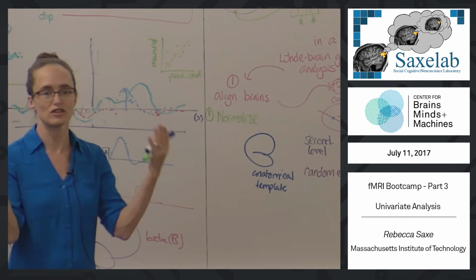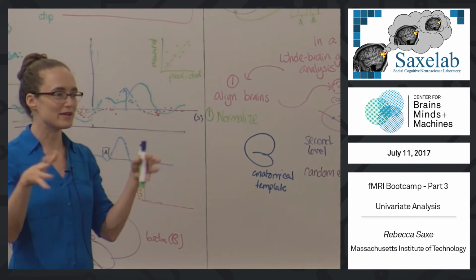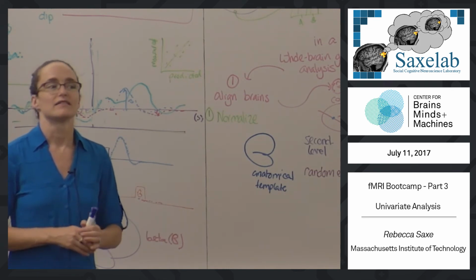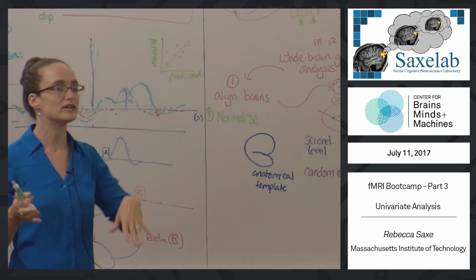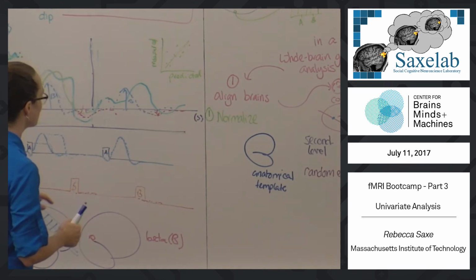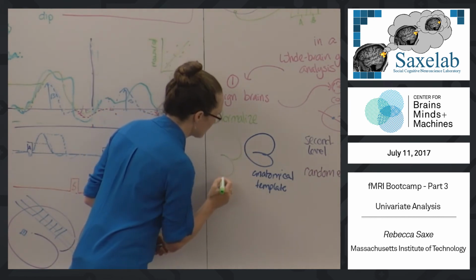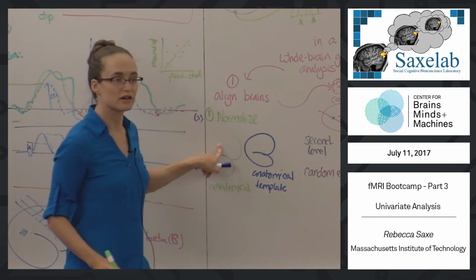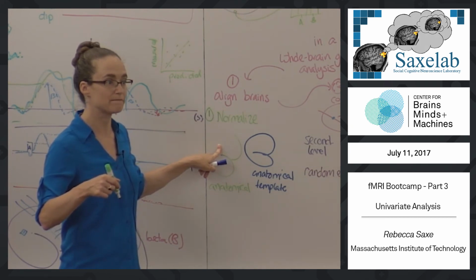So in any case, you should think of this as a picture of a brain, maybe some lady's brain, or maybe a decent representation of what brains look like on average. Okay, human adult brains, usually. The whole question about what to do if you're scanning kids or babies or people with only half a brain, and so on, for now, assume we're scanning adults, and this is a picture of an average adult brain. Okay? So that's what the template is. It's a picture of what an average adult brain looks like. And then we have, for this subject, the anatomical image that we took for this particular subject, right? This particular person's brain. Okay?